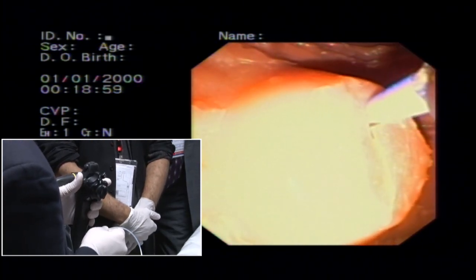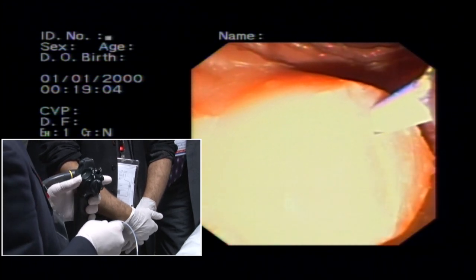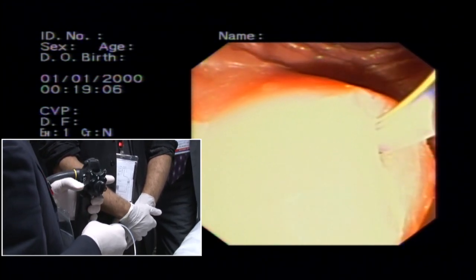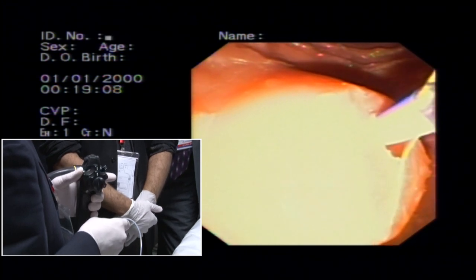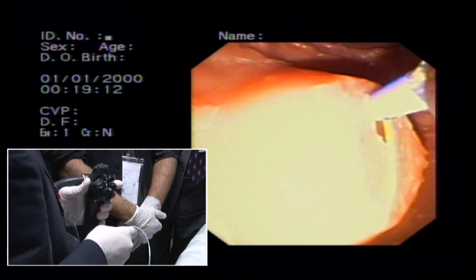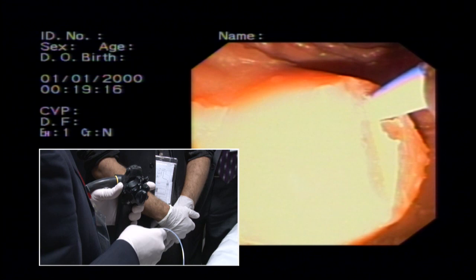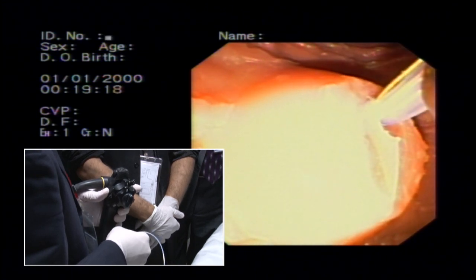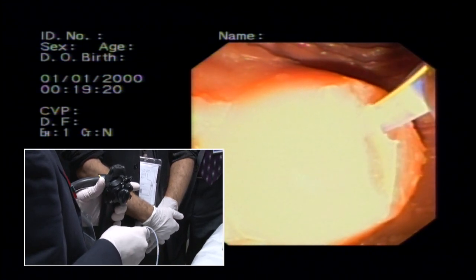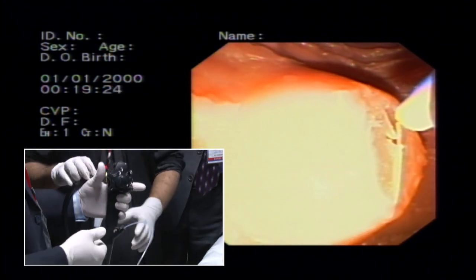But obviously if you have fluoro, just put fluoro like Wakash said and put the wire and you'll see whether it's going straight or whether, like Khalid very nicely showed, whether you are actually in the pancreas, you're in the pancreas and you turn around into a side branch, you keep pushing blindly, and you're obviously going to cause harm to you.